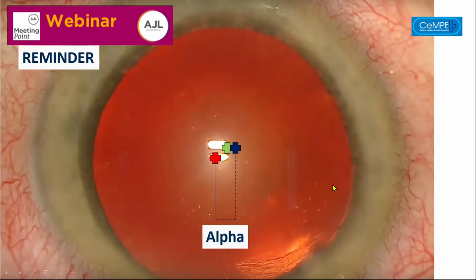The alpha angle is the important stuff here, because we are going to pay attention to the alpha angle in order to know if we are capable. It's one of the issues we tend to pay too much attention to for the post-op results with premium lenses.